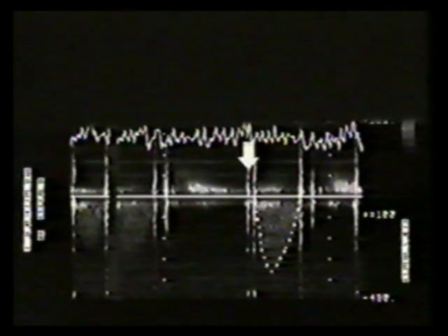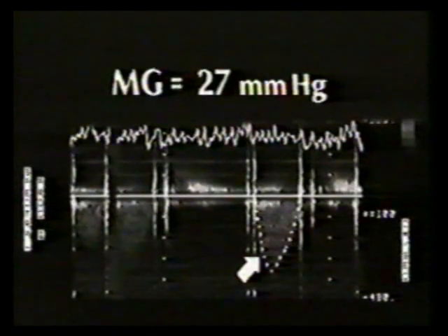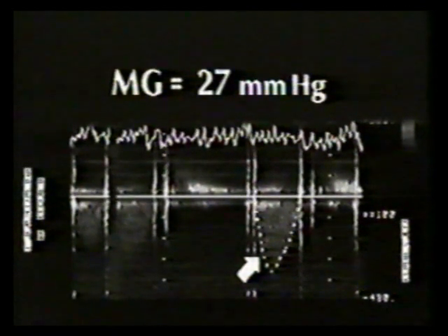In this freeze frame, the clicks from both prostheses are recorded. Mitral closure, aortic opening, aortic closing, and mitral opening. The aortic velocity spectrum has been traced to obtain the mean gradient, which was 27 millimeters of mercury. This is in the high normal range for a 21 millimeter aortic tilting disc.